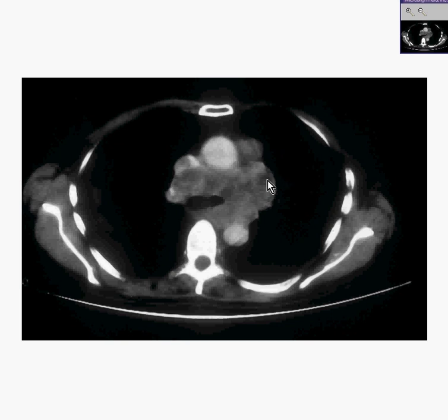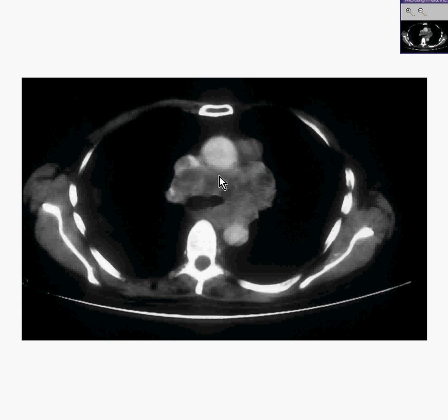And this is a tumor, isn't it? It's involving the mediastinum. At this point you don't know if it's really totally within the lungs or both in the lungs and mediastinum. But these look like they may be large mediastinal lymph nodes or tumor in this area. It's definitely not part of normal heart or lung appearances.